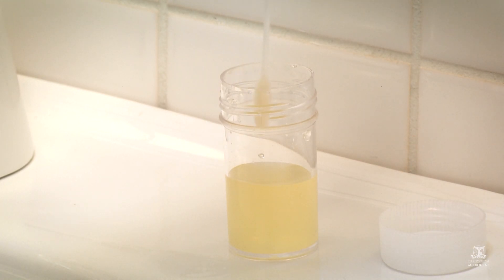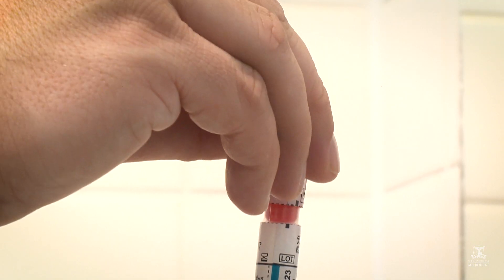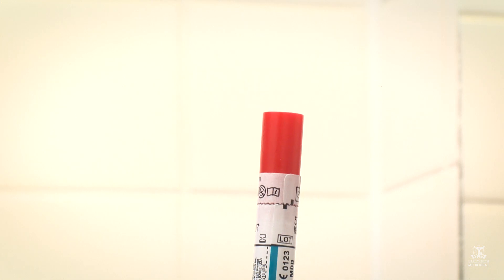Dip the soft tip of the swab into the urine. Keep the swab in for 10 seconds. Remove the swab from the pee and put it back into the plastic tube. Press the red cap until you feel it click securely.